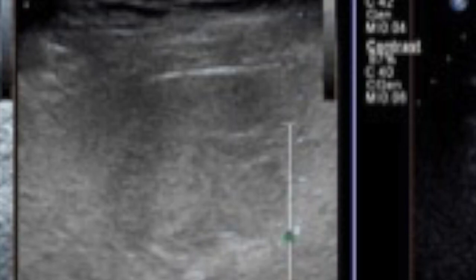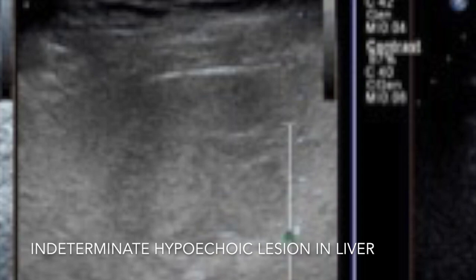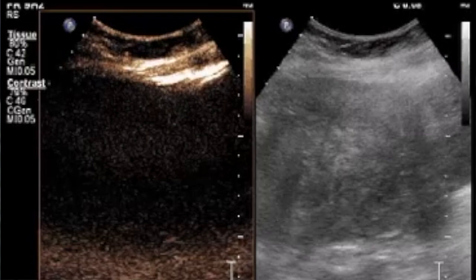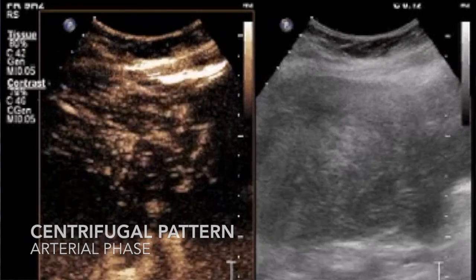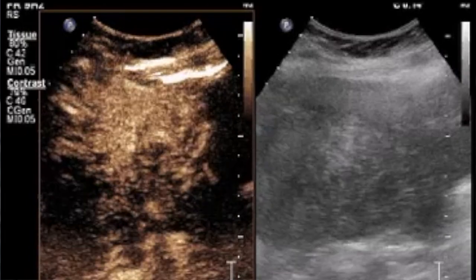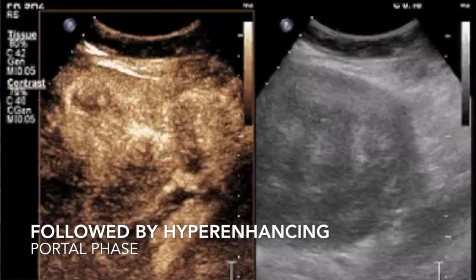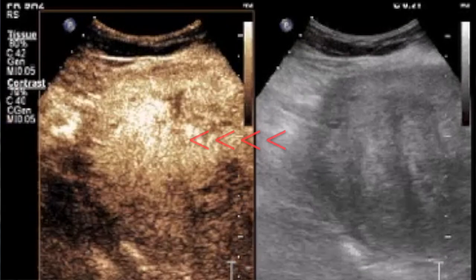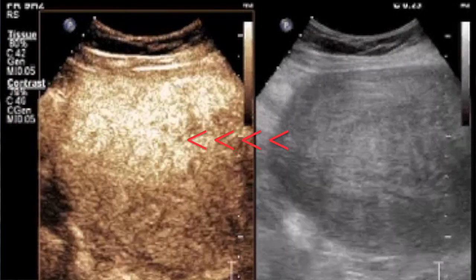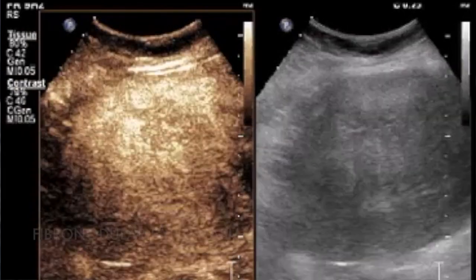Another case where we saw an ill-defined solid hypoechoic lesion in the liver. We performed the contrast study and we see that there is a centrifugal filling pattern. The lesion appears a little hyper-enhancing on the portal venous phases but iso-enhancing on the delayed phases, and importantly there is a hypo-enhancing scar which can be identified. So this was actually an FNH.